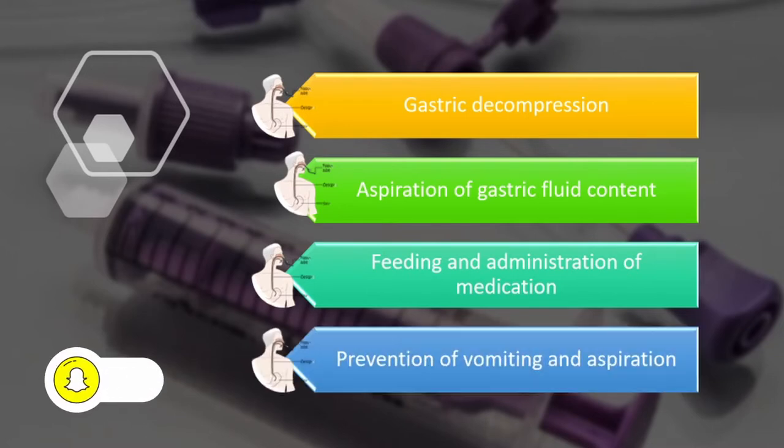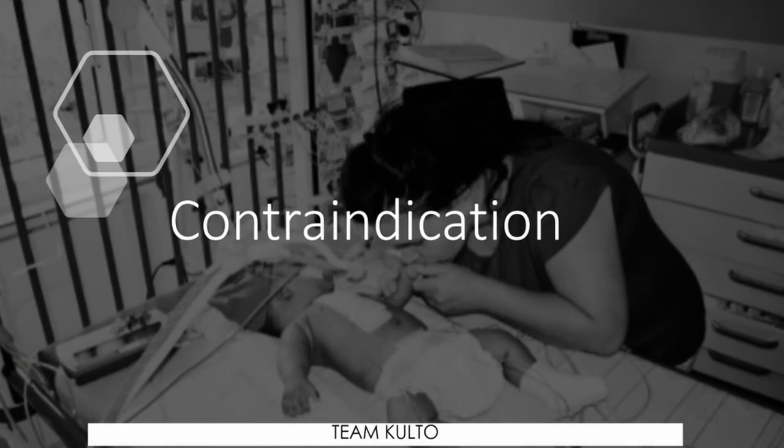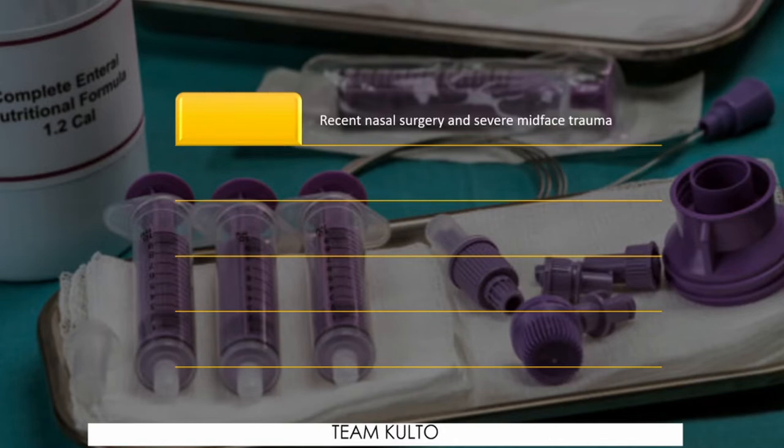Next is prevention of vomiting and aspiration. In trauma settings, NG tubes can be used to aid in prevention of vomiting and aspiration, as well as for assessment of GI bleeding. Next, we're going to talk about contraindication. Nasogastric intubation is contraindicated in the following. Una, recent nasal surgery and severe mid-face trauma.